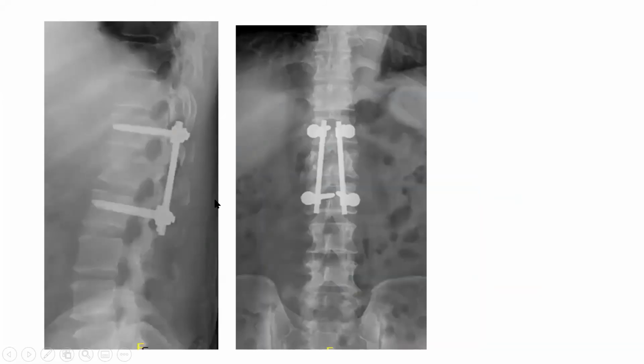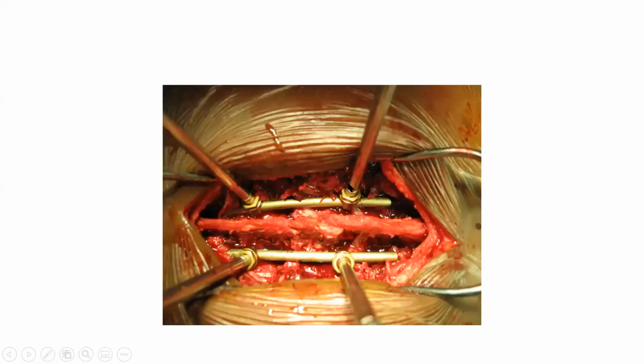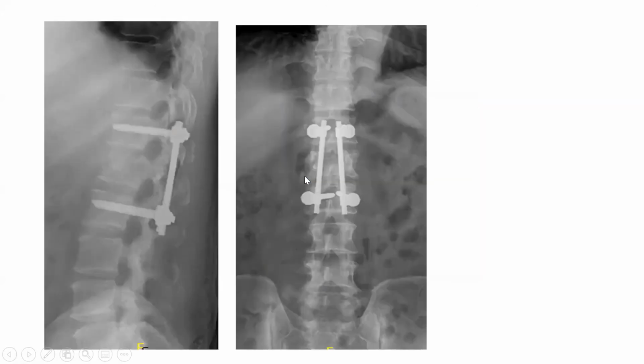And there's your patient post-op. So the screws work. The fracture is probably convergent when I put them in, and after distracting them, I've restored the body height to a large extent with the system. You can see that it's been fixed, and you've got a big bolt cutter which cuts these all flush, so you don't have things sticking out. It's a typical posterior trauma pedicle screw system.